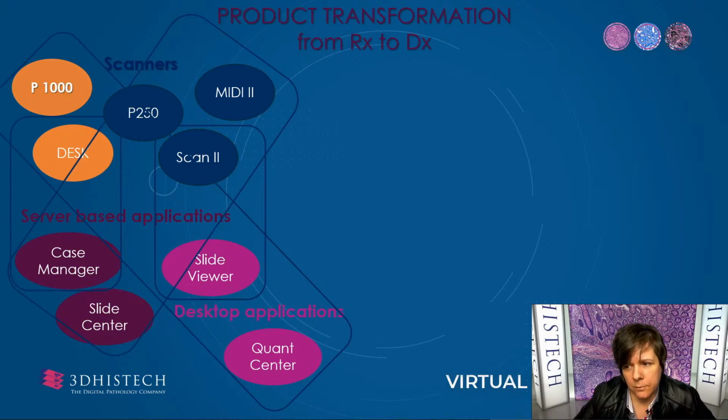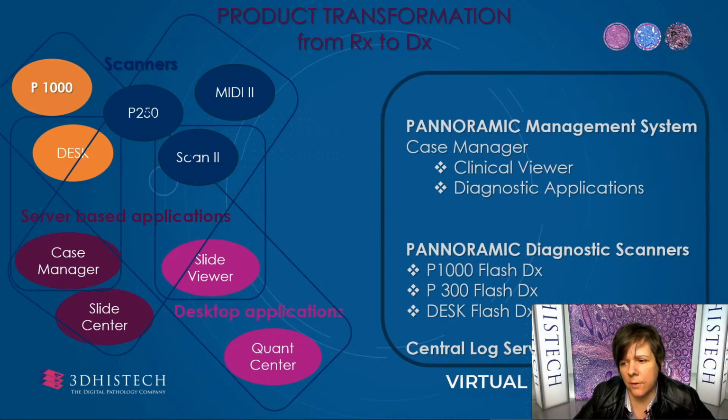A slide server is needed for storing the slides, and also some image quantification software products are available on the palette, and so on. The number of combinations is almost endless, and such a degree of complexity is almost impossible to follow.